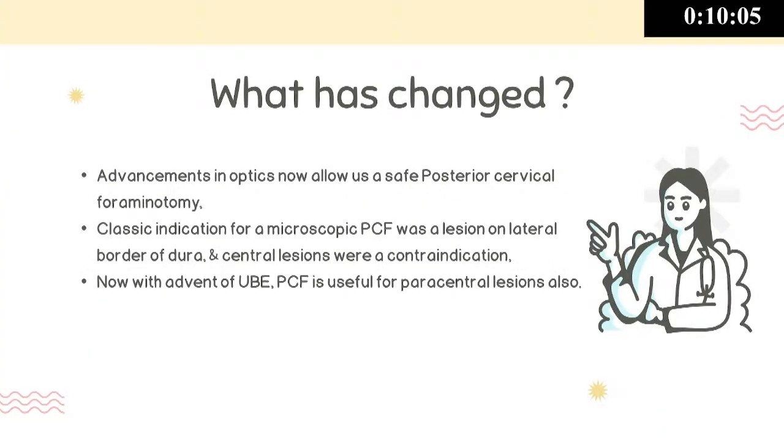Posterior approaches were restricted to a multi-level degenerative spine, where you would do lateral mass fixation or multi-level laminoforaminotomies. But with advancements in optics, things have changed. People were doing a microscopic PCF, then they shifted to a Destandau-assisted PCF and a PCIF. Now, with the availability of biportal endoscopy, people are doing a UBE PCF and PCIF. Between the two, PCIF is the most challenging. It is the most taxing on the surgeon because it has a very steep learning curve.